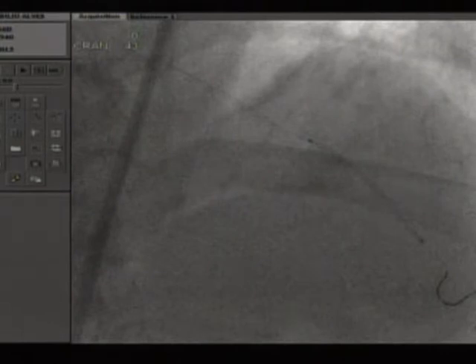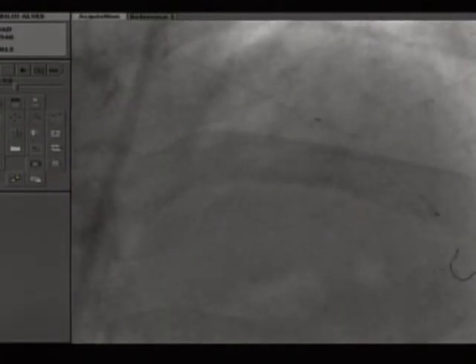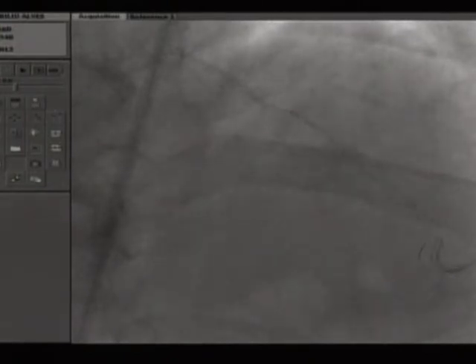Yeah, I think in the U.S., even in centers that don't do a lot of IVUS, true bifurcations like this really do have a role to play in terms of both morphologic assessment and choice of therapies. It may be that a cutting balloon might have been a better preconditioning technique, and the one way that you might save yourself from having that second stent would be if you could prepare that diagonal sufficiently. In other words, there are 2 ostia, right? Yeah, exactly. And it needs to be pre and post, definitely.